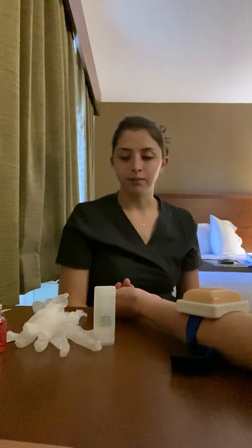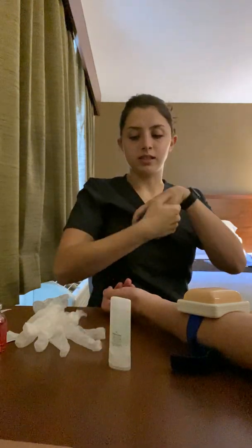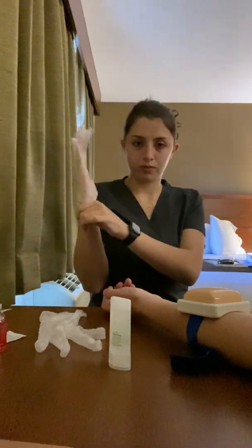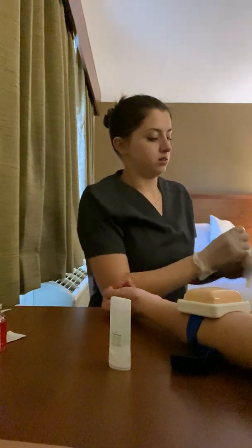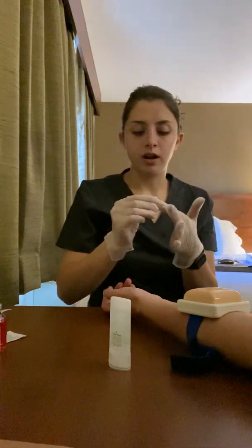I do not. Okay. So first I'm going to perform hand hygiene with hand sanitizer. Then I'm going to don some gloves, which are clean gloves. Then I'm going to prepare the medication.